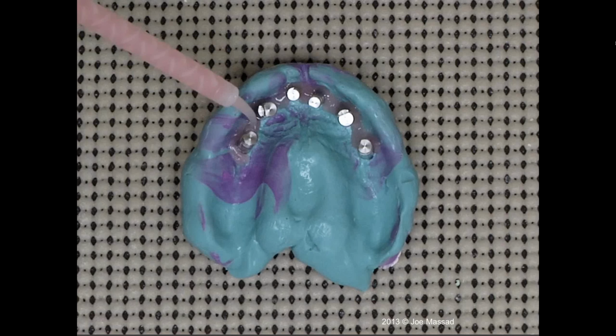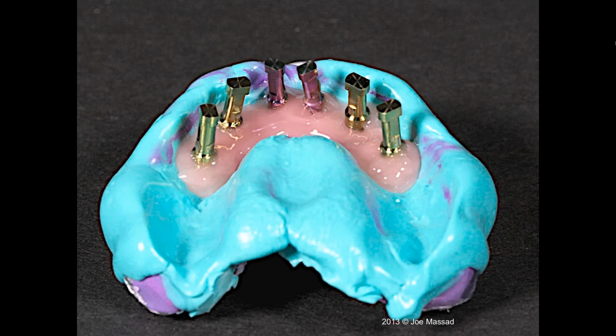Now you see the analogs are now placed with the impression copings, and the material that the impression coping sits in is very stiff, because as you recall, I put that rigid viscosity inside the tray so that underneath the light viscosity, which was injected around the impression copings, it would support it. So your finger won't just accidentally move the top of the analog, and many times that has been an issue.